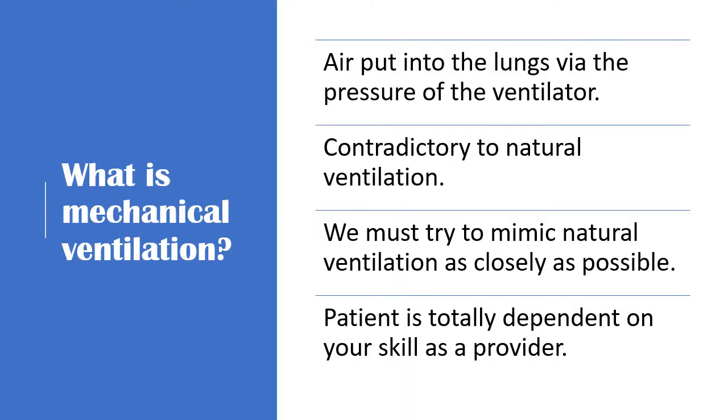So what is mechanical ventilation? Believe it or not, it's actually completely contrary to normal physiologic ventilation. Normal physiologic ventilation involves moving up and down the diaphragm, relaxing and contracting. In this case, the diaphragm isn't working at all. Air is going to be forced into the lungs via the ventilator. Your patient's either sedated or sedated and paralyzed, so that diaphragm's out of the picture. All the air has to be taken into the lungs and back out by the ventilator.